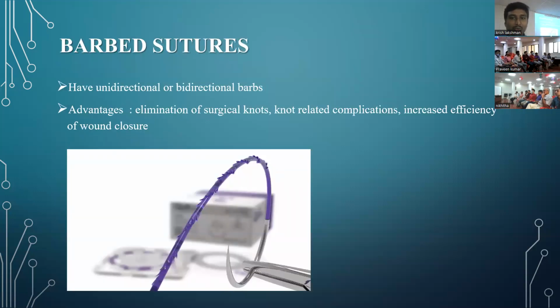And we have the newer barbed sutures, in which the barbs can be unidirectional or bidirectional. The advantage of barbed sutures is that there is no requirement of surgical knots, it decreases knot-related complications, and there is increased efficiency of wound closure.